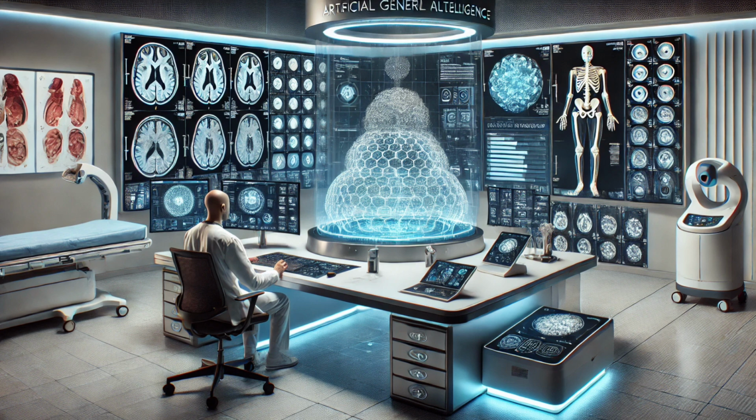Can't wait. Yeah, it really is amazing to think about how AI can change things. So we were talking about AI reducing errors. Are there specific types of errors that AI is particularly good at catching? Oh, absolutely.